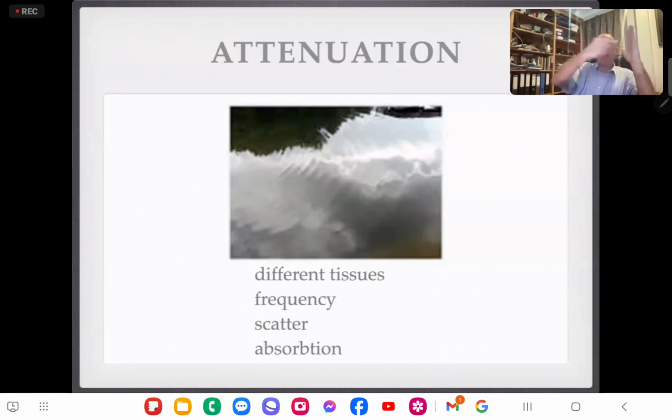The reflection from the second one has got to go a total of 4 meters. So it's gone much further. So by the time the signal gets back after 4 meters, it's going to be a much smaller wave than the one that's only gone 2 meters. So what you would hear if you stood here was, you set off a bit of ultrasound, a bit of a wave. You'd hear back a bit, bit. The second one you can barely hear, it's so quiet.